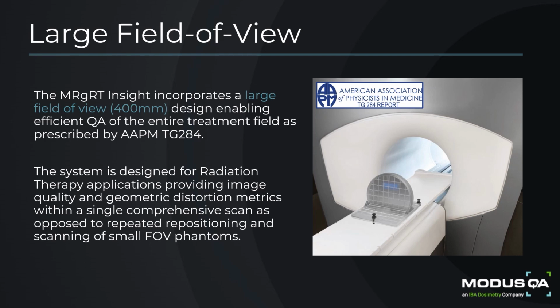And so typically for these sorts of large FOV cases, smaller volume phantoms will require a lengthier QA process because the physicist would be required to repeatedly reposition the small phantom at multiple areas on the table, and then consecutively scan those phantoms 6 or 8 times in order to cover the same treatment FOV, as opposed to the Insight Phantom's one-time positioning, single acquisition process, which may likely greatly expedite the QA workflow.